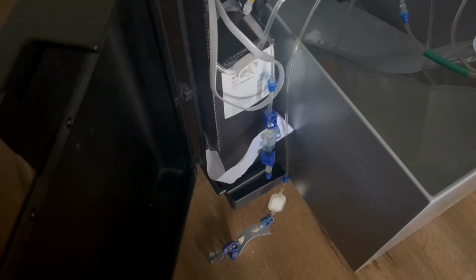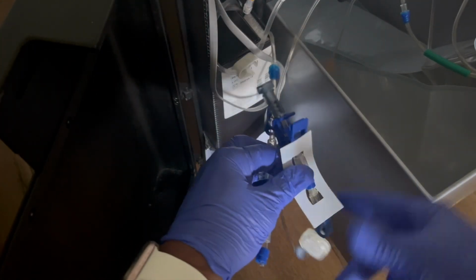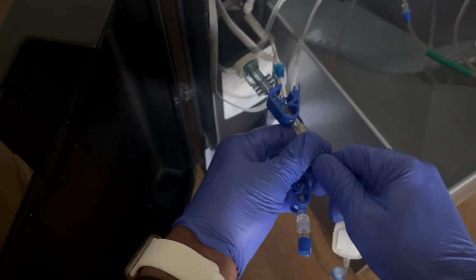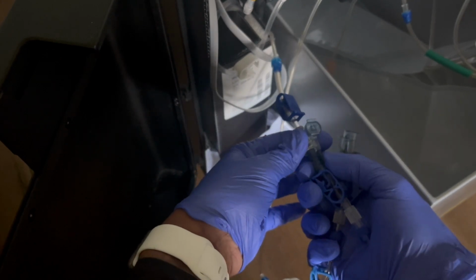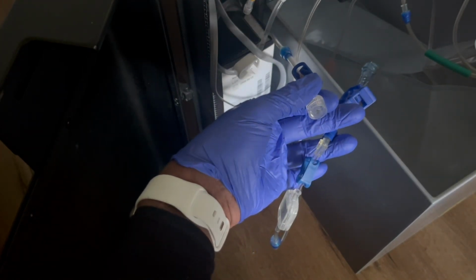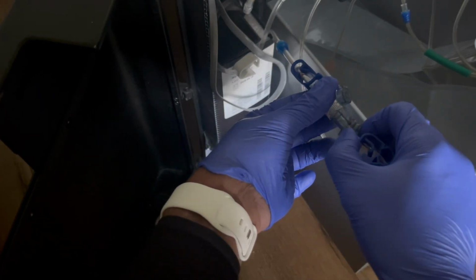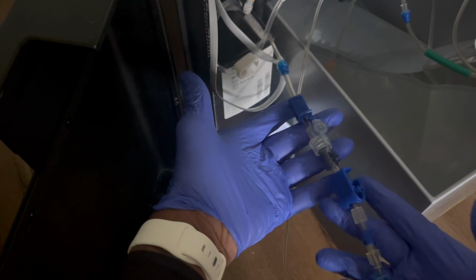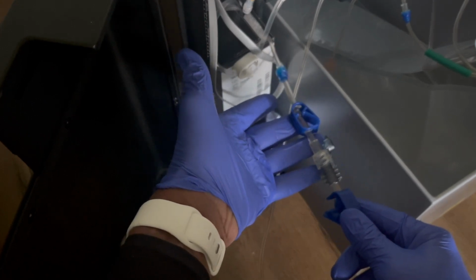All right, so after that you're going to want to put on some gloves for this next part, because cleanliness is next to godliness. So put your gloves on. Remove the paper holder, and then tighten that part of the tube right there. There you go. Alright, and you see that the old connector is coming off, and we are putting the new connector on. At which point you want to make sure that your clips on the bag's tubes are open. After you connect it and secure it tightly, then you're going to want to open up the clip on the tube connected to the pack, which is the black box right there behind my hand.